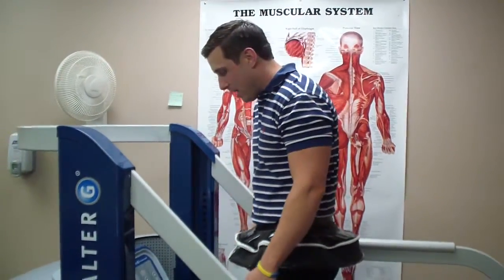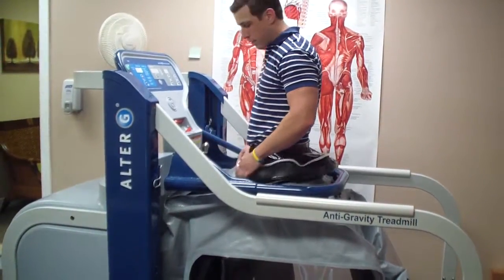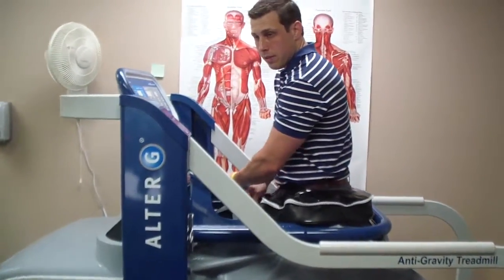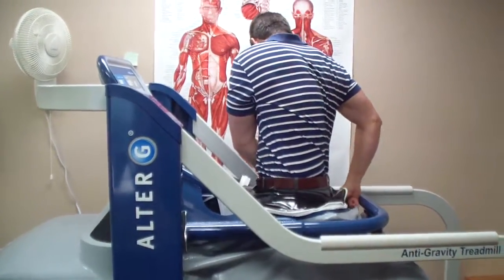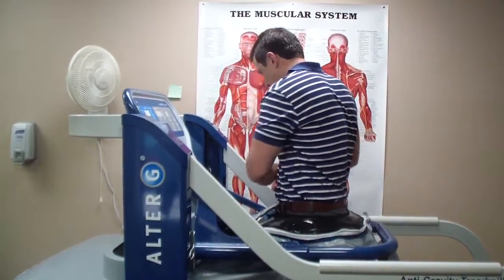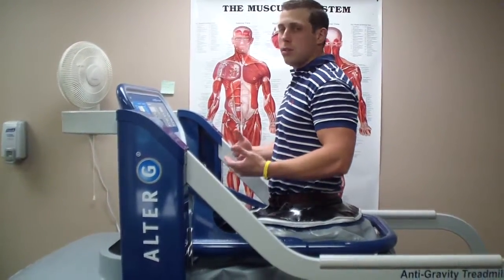We're going to show you how to use it. It's very simple, very light — you can almost pull it off with just one finger. This bar always lines up with your hip bone. You lock yourself into place, and there's a zipper here — you're pretty much just zipping yourself into an air chamber. There's still a lot of freedom of movement; you have about the size of a hula hoop to move in, but that takes a little getting used to.